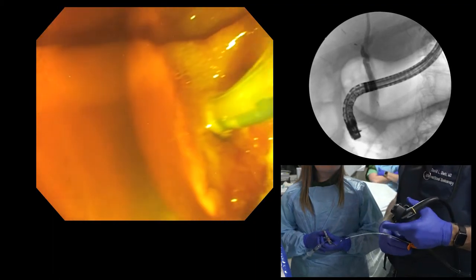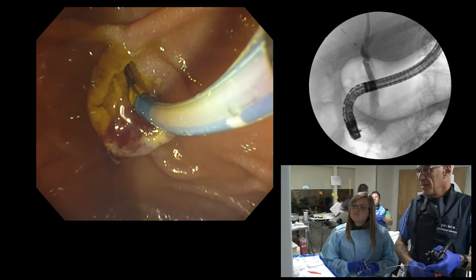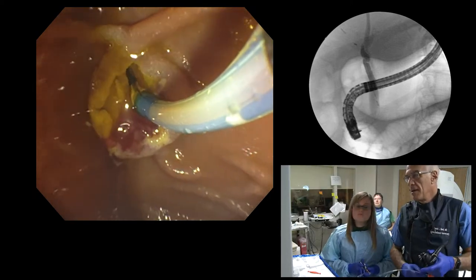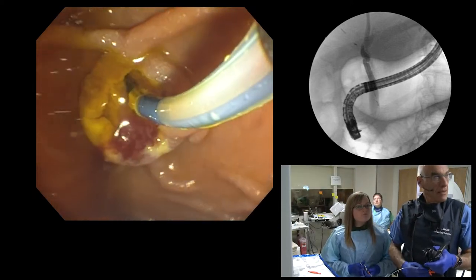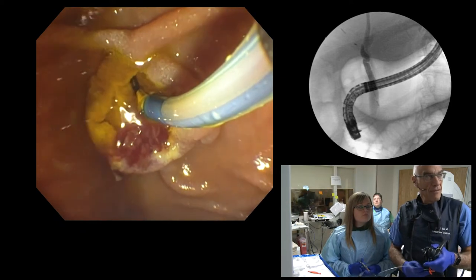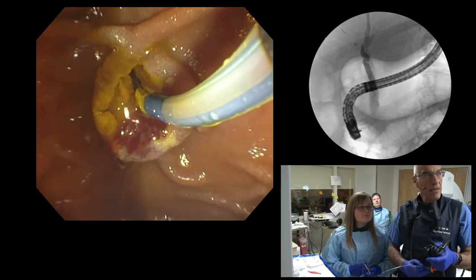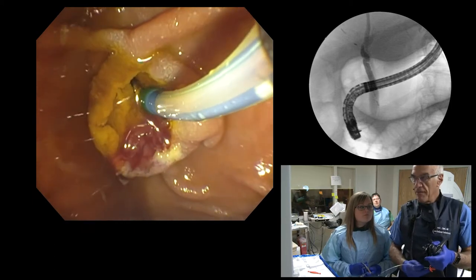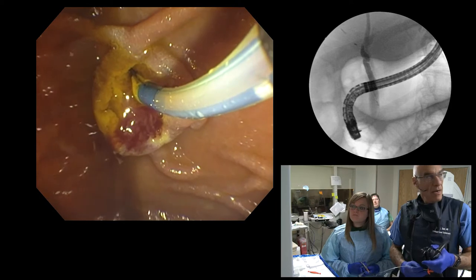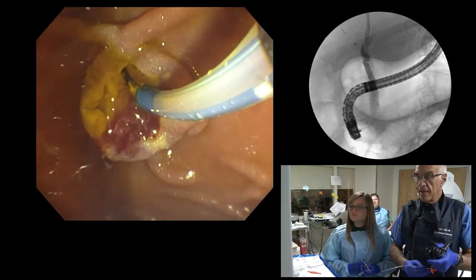I don't know if we have an angled wire — a delta wire would be perfect or angled something. I'm not sure where the take-off of the bile duct is. It seems like a somewhat low take-off of the cystic duct, which I'm finding easily. I can try an angled guide wire to see if I can find the common hepatic duct.